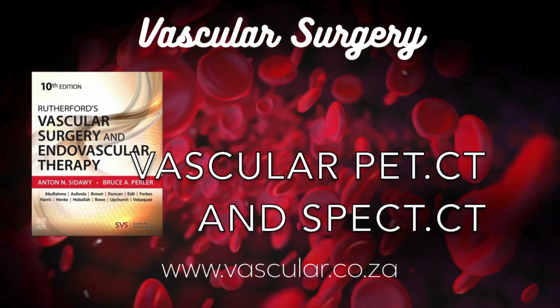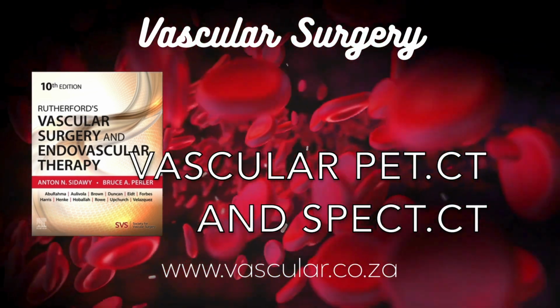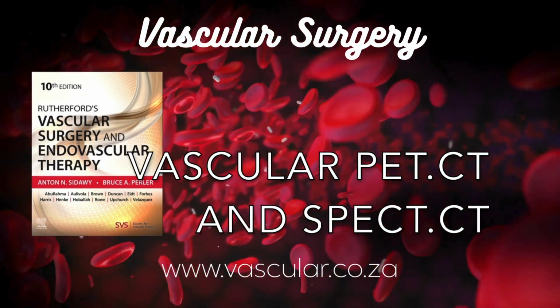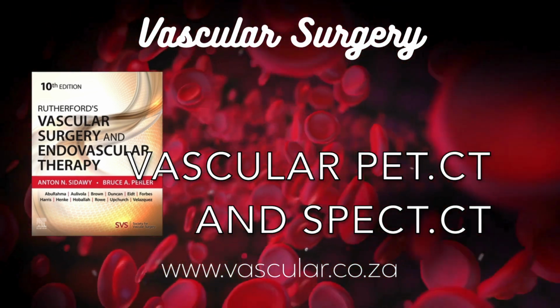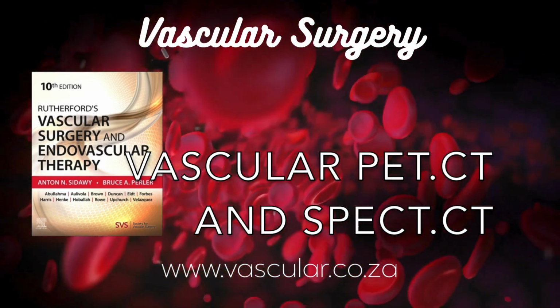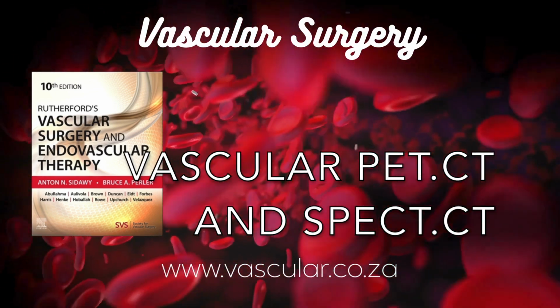Precisely. They emit a very small amount of radiation. Not enough to be harmful in these diagnostic doses, but enough for sensitive cameras, gamma cameras for SPECT, PET scanners for PET to detect. And the big win is seeing these processes happen in real time. Yes, visualizing the function, the physiology, often way before you'd see a lump or bump on a traditional scan. Early detection. Okay, SPECT and PET, you mentioned both. What's the difference? And then where does the CT fit in?